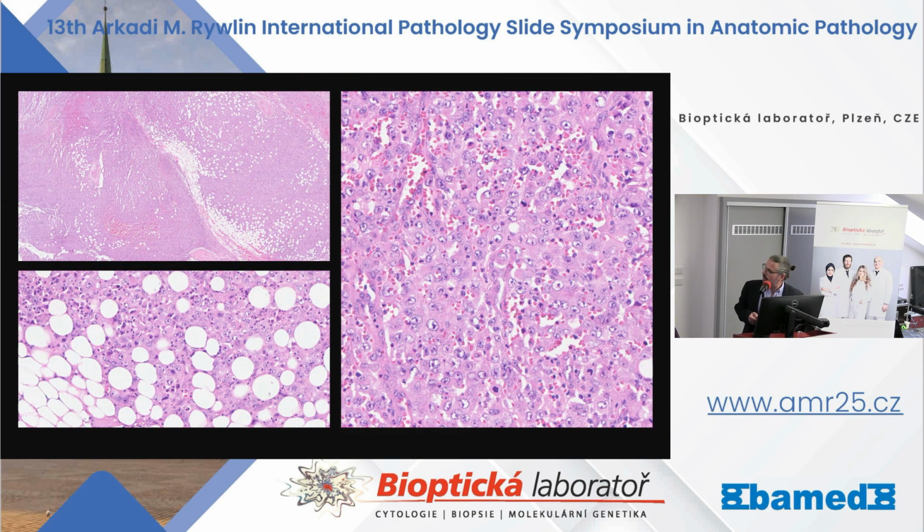And this is the actual microscopic aspect of the tumor. You can see it's infiltrating the tissue quite diffusely, solid looking, and the morphology of the cells is clearly undifferentiated. Okay, epithelioid cells, nice vesicular thick nuclei with very prominent nucleoli.